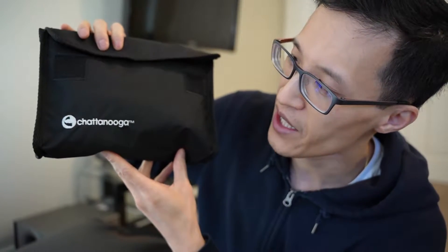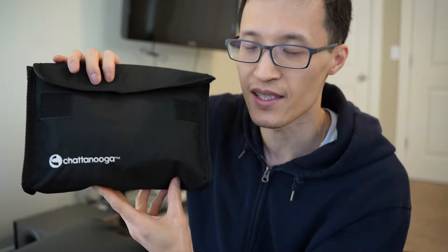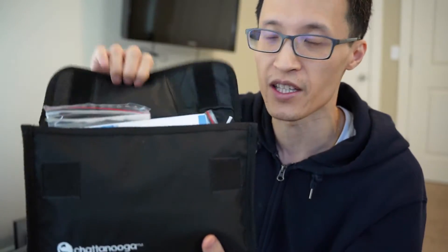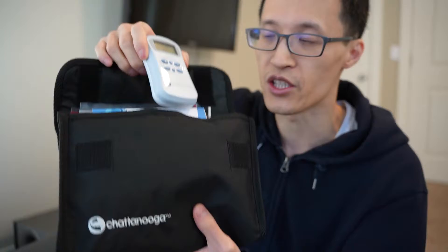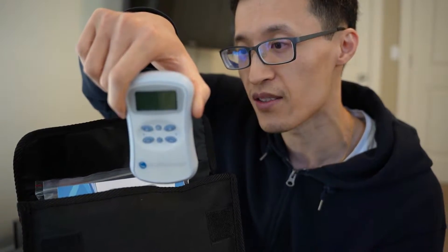Hey guys, it's Paul here and today we're looking at the Chattanooga TENS NMES device — this is the Primera version or package. We're going to unbox it here just to give you an idea of what it looks like. This is what's inside the package — you have the Chattanooga TENS NMES device.